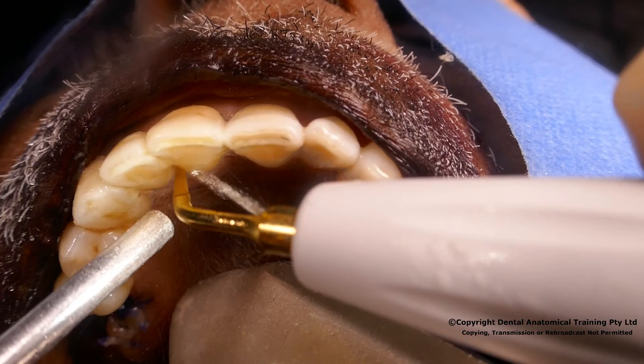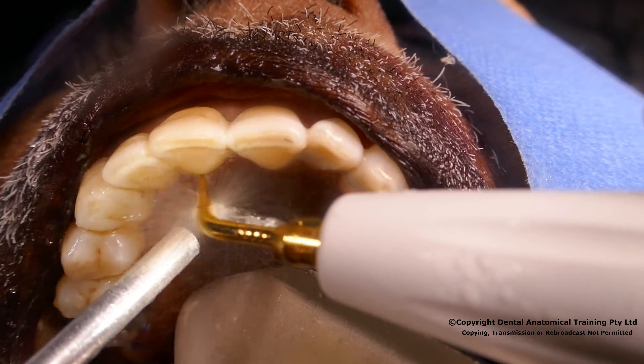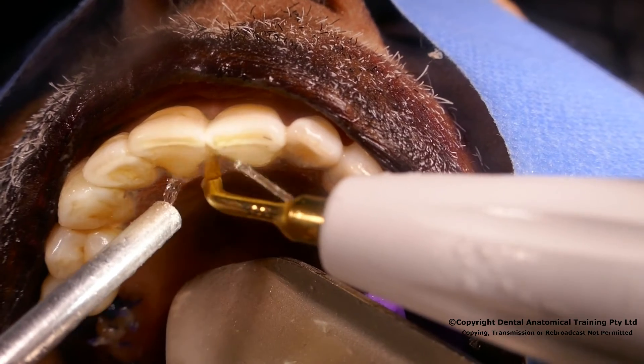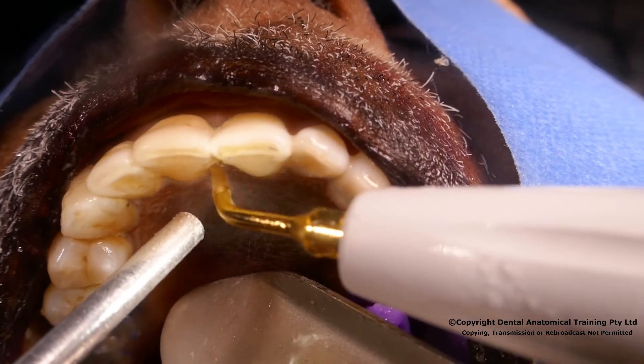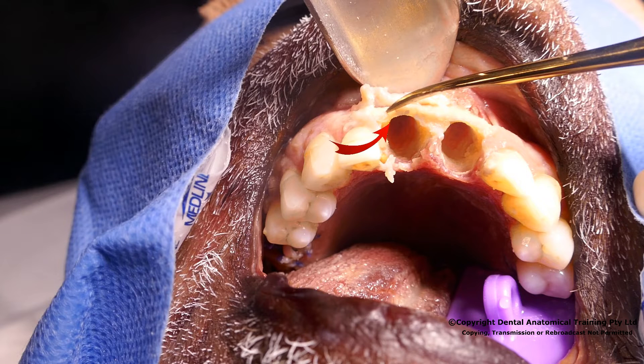Once the labial is completed, the palatal is carried out, and likewise with the interproximal connections, until we are satisfied that there has been sufficient disruption of the membrane to be able to remove the tooth without trauma to the surrounding bone. Here you can see that the bony contour has been preserved intact. Although not something that would be done clinically, we raise the mucosal flap here to demonstrate the bone by direct observation.